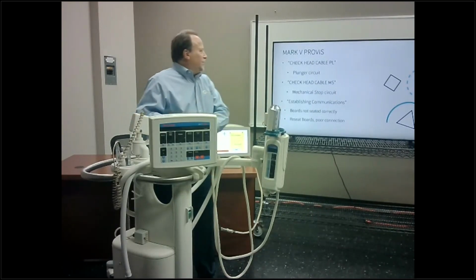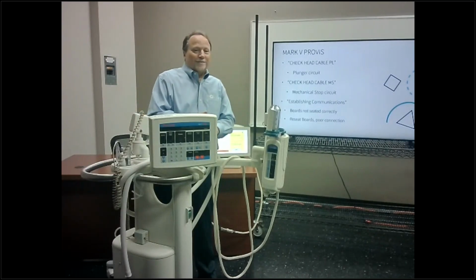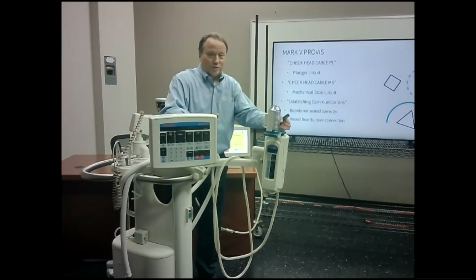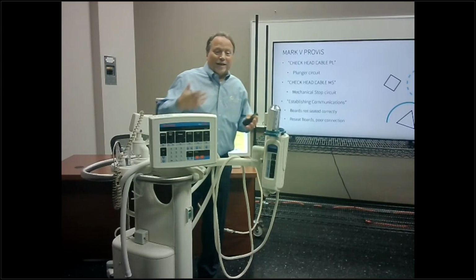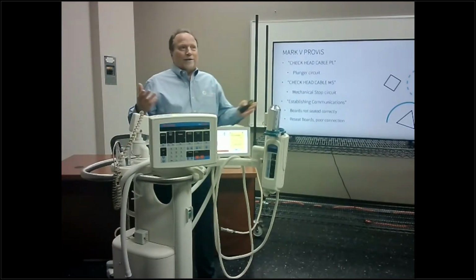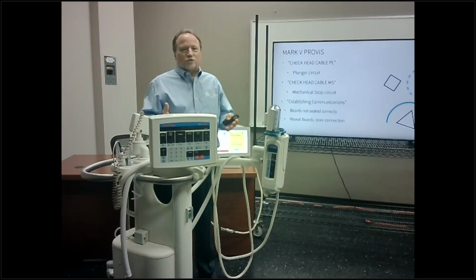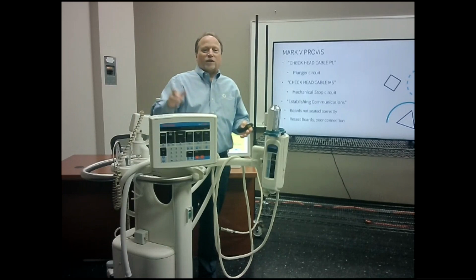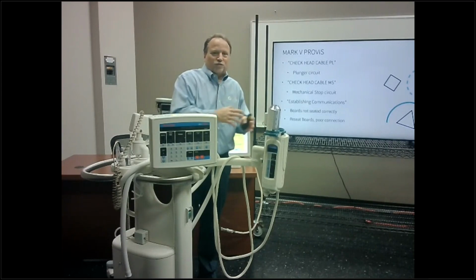The next one is check head cable MS, mechanical stop. So the plunger was working fine, but the mechanical stop is having the issue. So troubleshoot the mechanical stop issue, not the head cable. In my 15 years or so of working on injectors, I have replaced 3 head cables, and that's only because they ran over it with a table or a gurney. It wasn't because it was actually damaged from use.